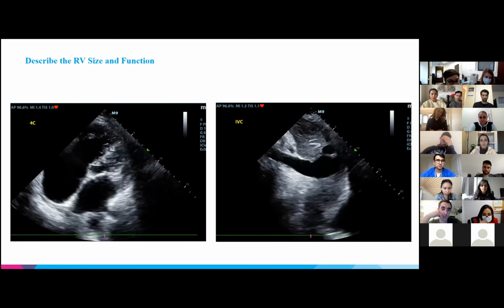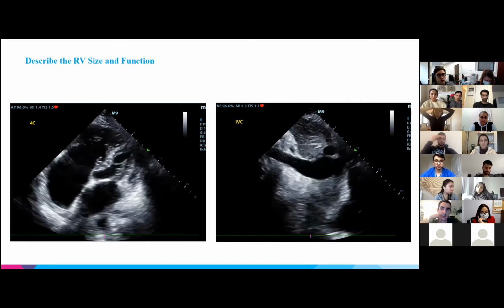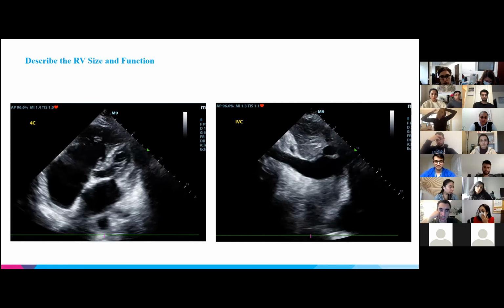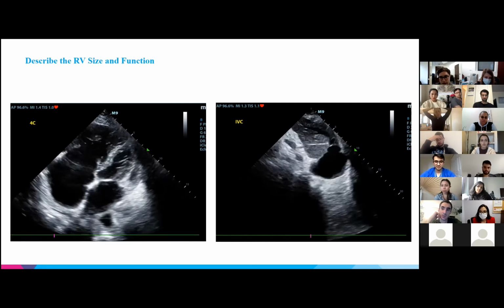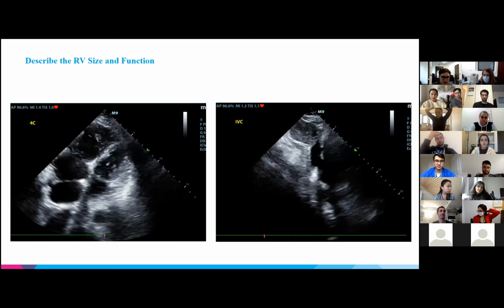Yeah, so you can see the 2 leaflets don't connect and meet up, right? The right heart is so enlarged that the tricuspid leaflets can't even fully close. So even without adding color, I can tell you right now, this patient has at least moderate to severe tricuspid regurg. And that's what she had. They actually said it was very severe tricuspid regurg, even on her formal echo.